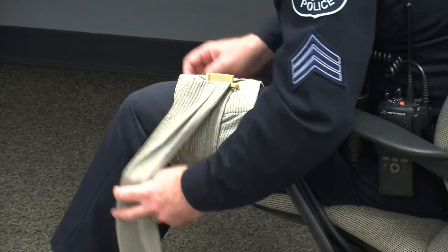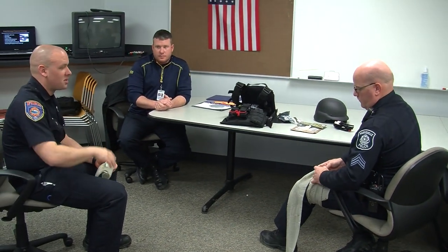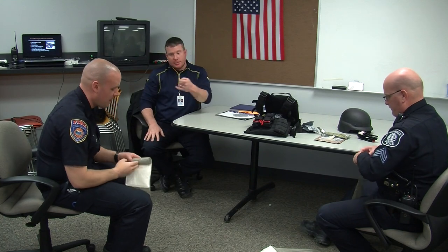Especially with head and neck, working in an ambulance, trying to put pressure on somebody's head is just a pain in the butt, because you can't just tape it right to their head all the time. This thing's going to be awesome to use on that, and on a neck wound. You can't just wrap around their neck. Pressure, but he'll show you.